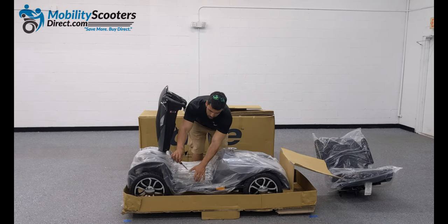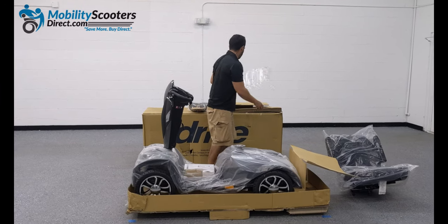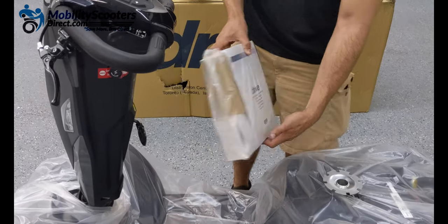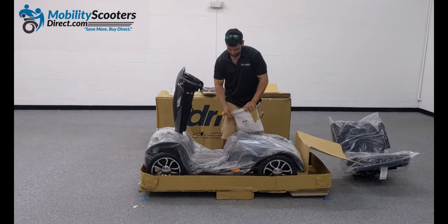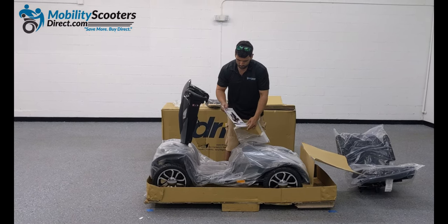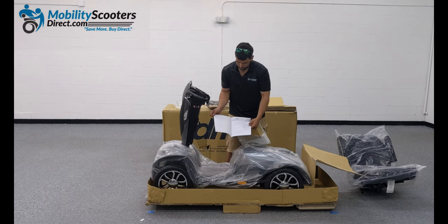Once the tiller is lifted up, you can cut the bubble wrap that's protecting the packaging that contains the user manual, the rearview mirrors, and the charger. The charger and the rearview mirrors come in separate boxes. Simply open up the packaging. Make sure to not discard your user manual — keep that handy and read through it thoroughly so that you know how to operate your unit safely.